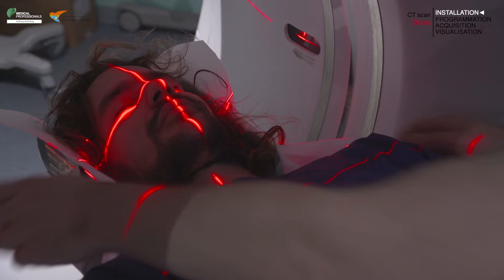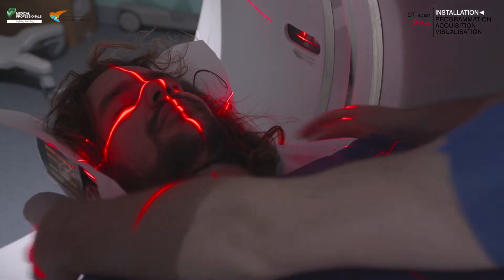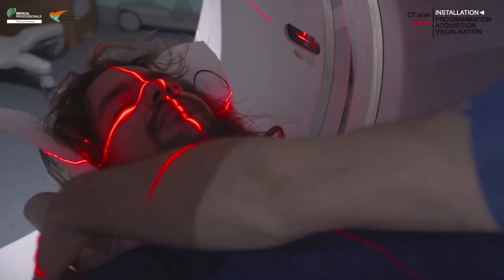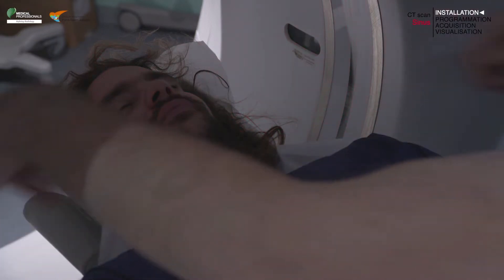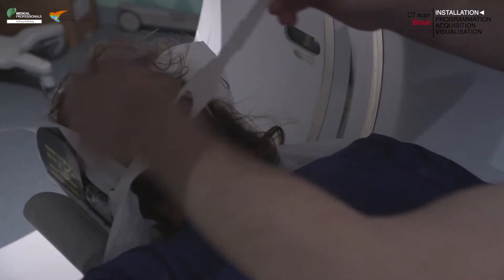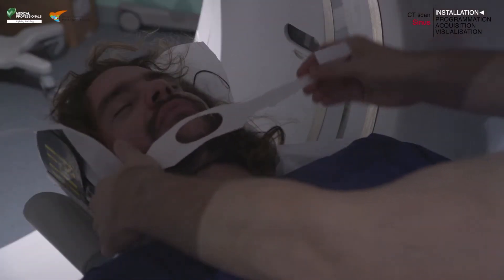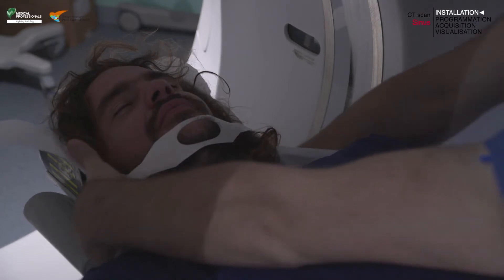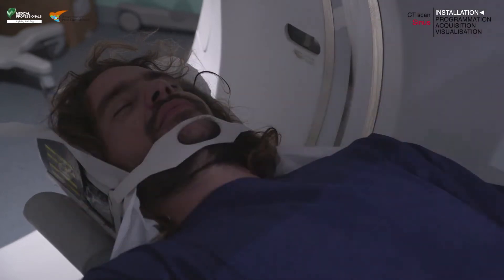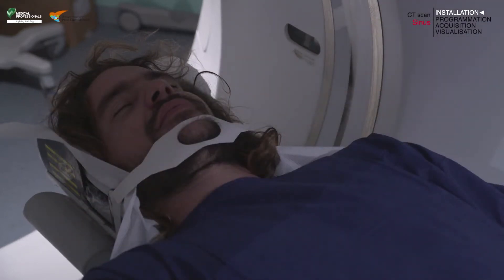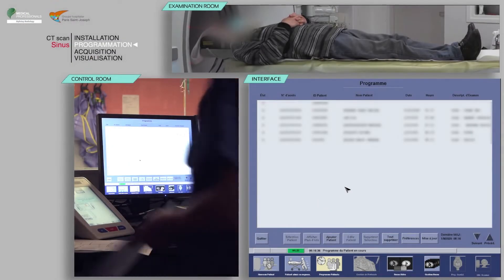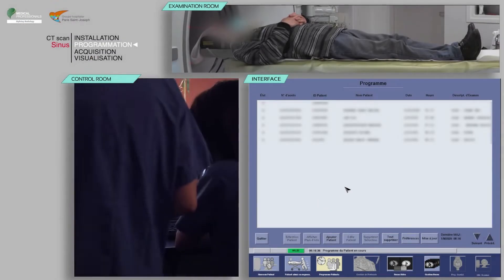To help your patient maintain the position, you can place a restraint strap on the chin or forehead. Remember to close the doors of the examination room and perform proper hand hygiene, such as the use of a rub with alcohol-based hand sanitizer.